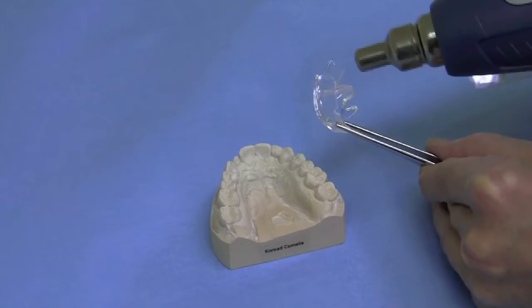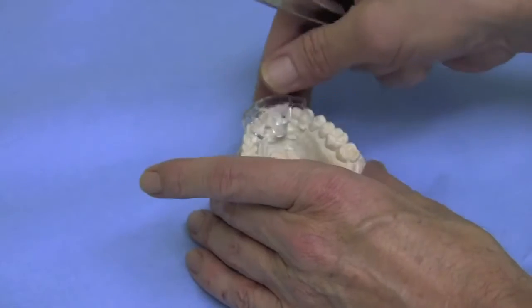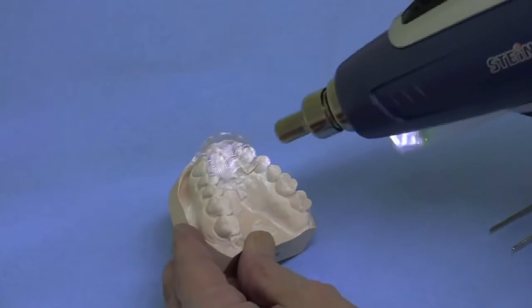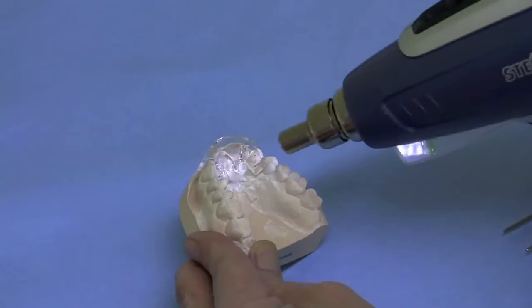First we desire an improved general adaptation. Set the heated splint onto the model and press it firmly to place. To optimize the fit of specific areas, you can work directly on the model.